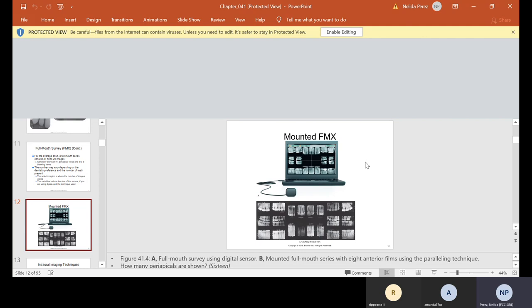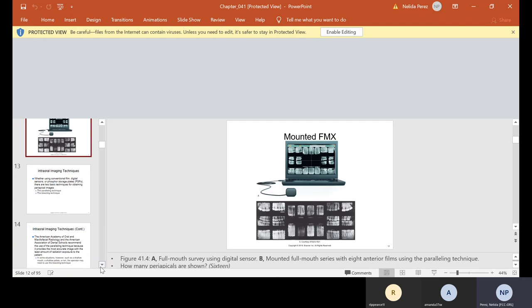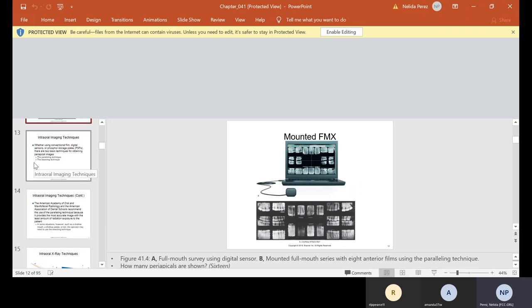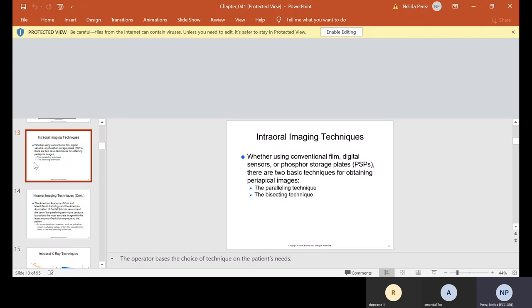Here's a mounted FMX. On the top picture you have digital, and on the bottom picture you have what we've been doing — mounting a full mount set of x-rays. When you take digital with the sensor, it'll mount it for you. What you have to pay attention to is where the computer is telling you where to go. With film FMX, you have your choice of where to begin. What's important is a sequence, because a sequence is going to help you take images quicker and avoid repeating x-rays.